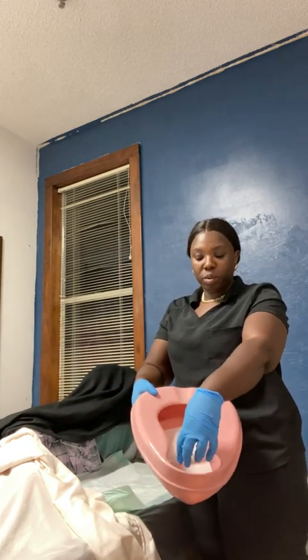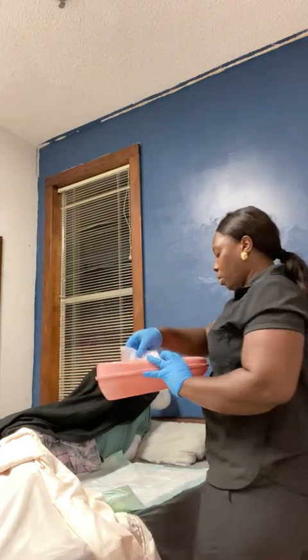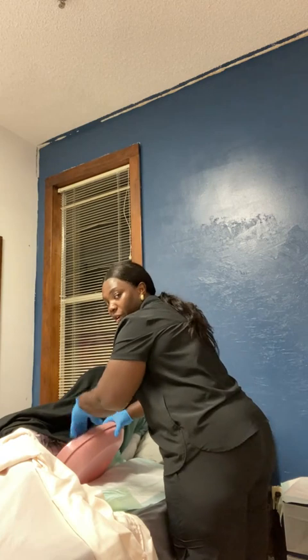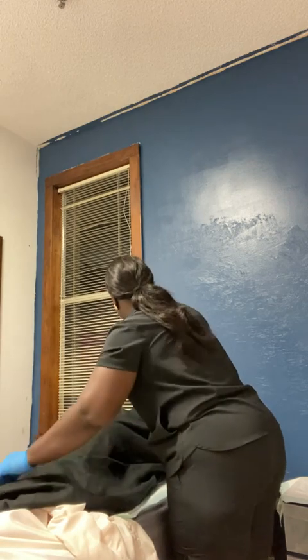I'm going to put this largest part on the largest part of the body, which is the buttocks. And this part will be closer to the crotch, which will be the area for the vagina and the penis. So you're going to use this part for the front, and you're going to align their buttocks here. Okay, Mrs. Smith, I'm going to place the bedpan under you, and you're going to kind of tuck it down under, like when you were doing turn and repositioning. And you're going to slightly grab the hip and say, Mrs. Smith, lay back, please. And her body should naturally fall to the bedpan.